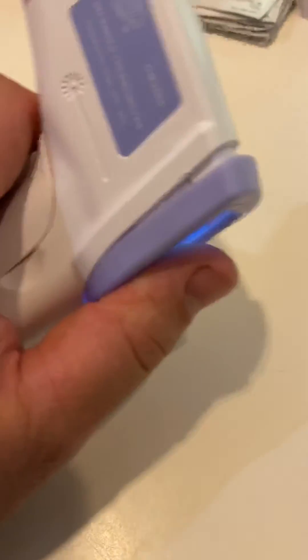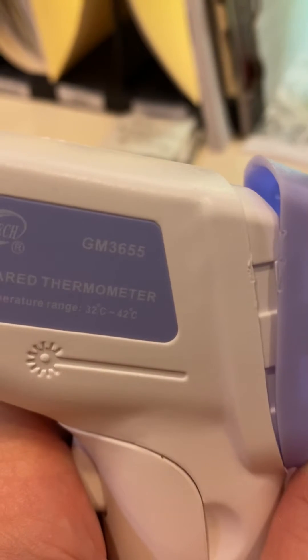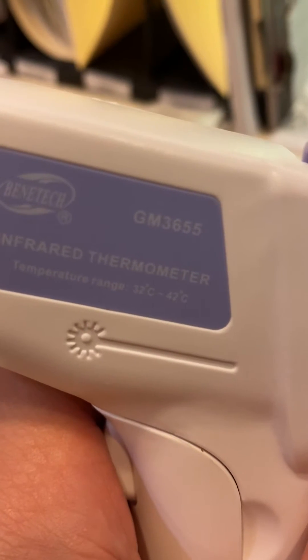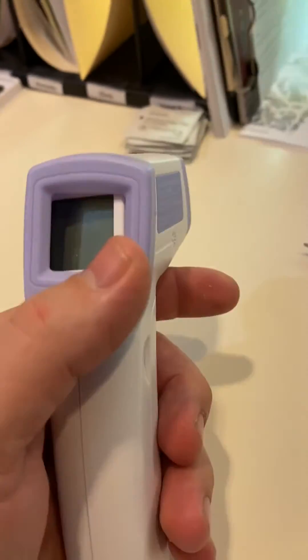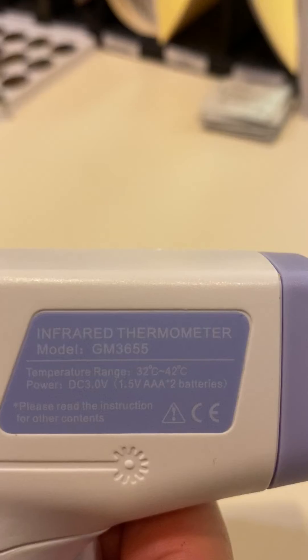What we have here is a Benetech GM3655 infrared thermometer that reads 32 degrees Celsius to 42 degrees Celsius. In the United States we don't use Celsius very much. It's model GM3655, by the way.